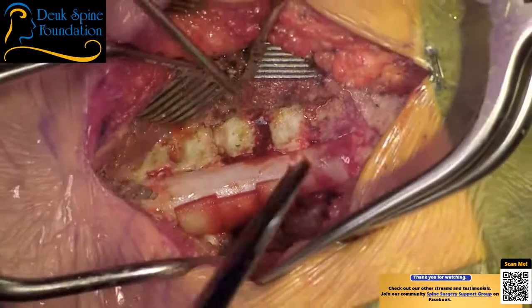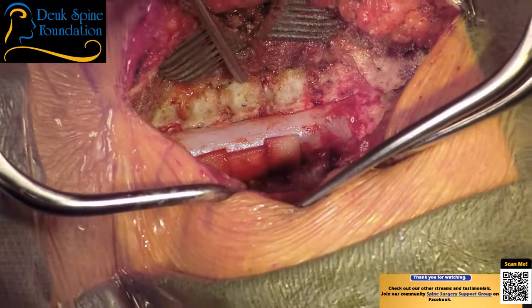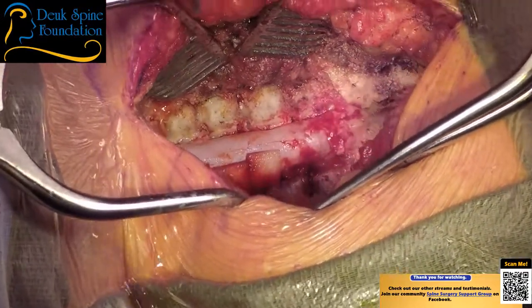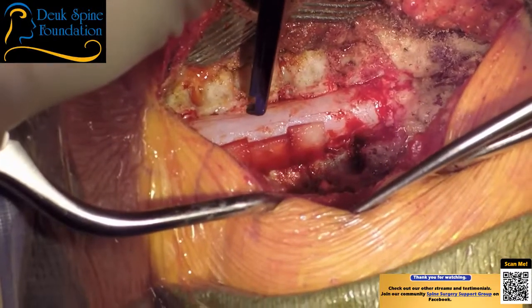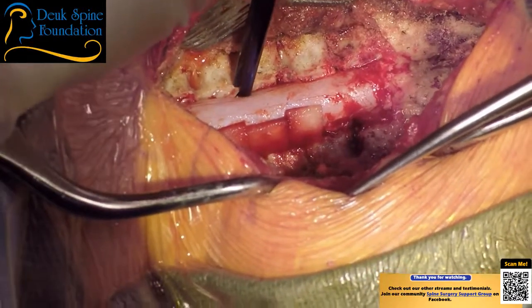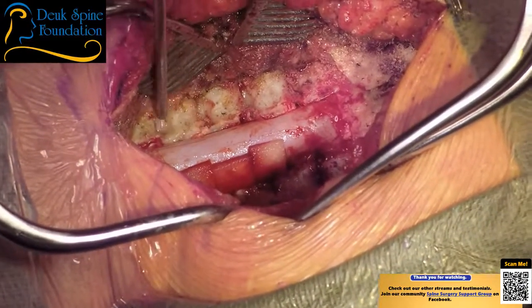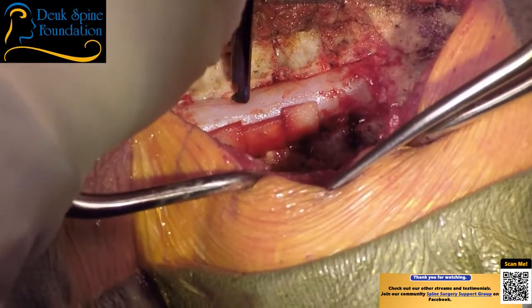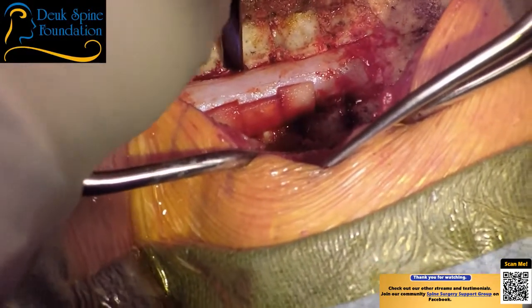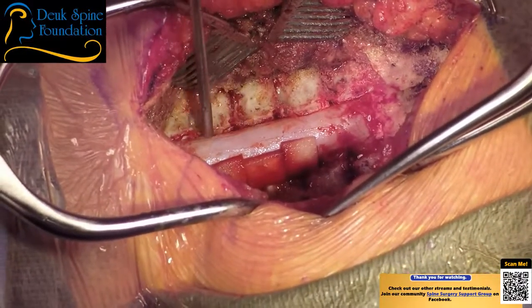But you see you also get some foraminal bleeding. That's just veins. That's good. I need it. It's really hard with the angle. Bit of an unusual angle because the wound is so deep. My target is so deep, so my entry trajectory has to be modified. So I'm kind of more over the patient's side.